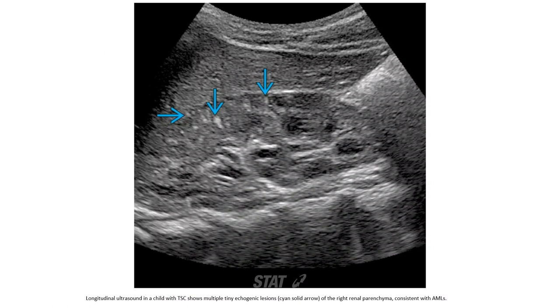Ultrasound in a patient with tuberous sclerosis complex shows multiple tiny echogenic lesions throughout the renal parenchyma, consistent with angiomyolipomas.